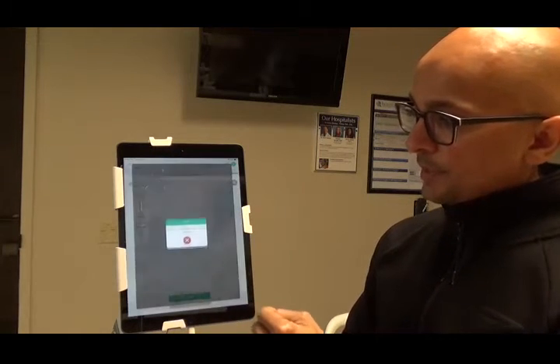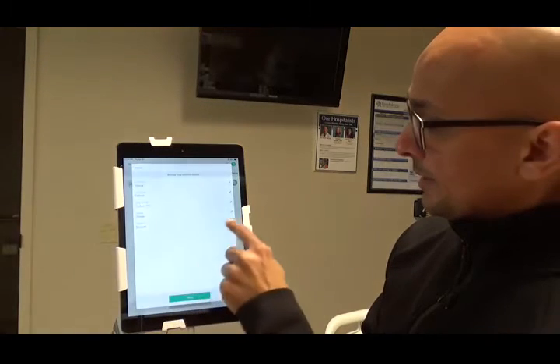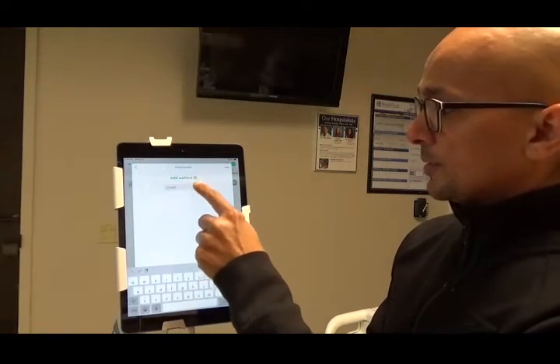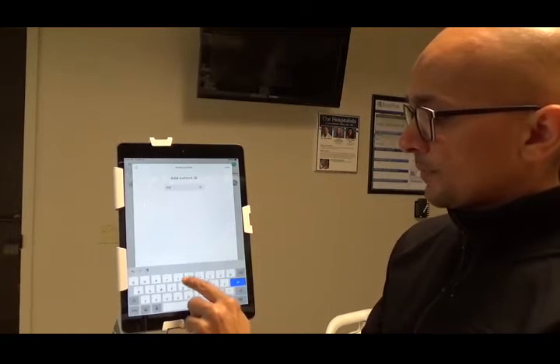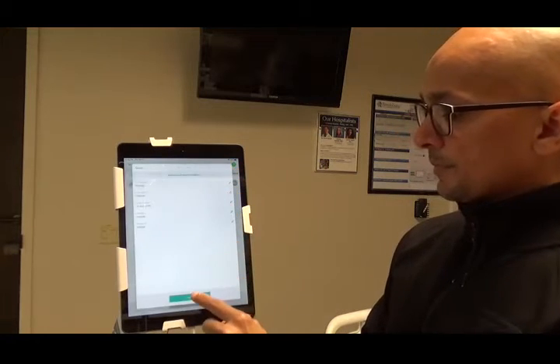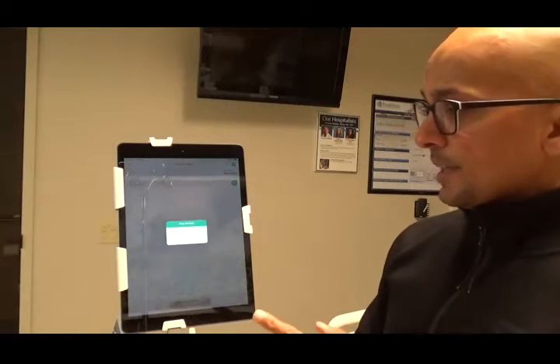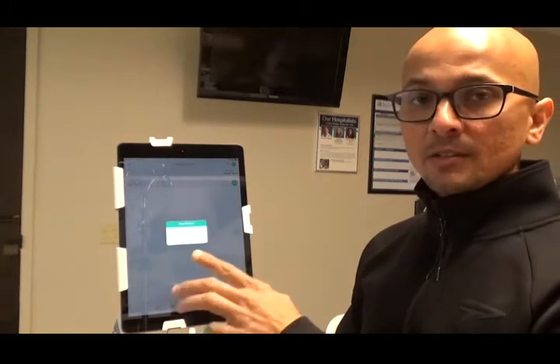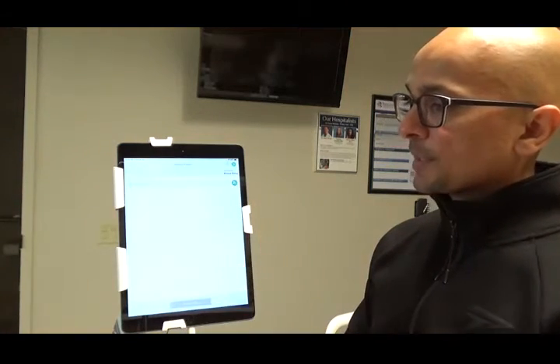Say save. Oh, one of the letters, because I put the and sign in there. That's why. So let me just take that out. We'll choose some random numbers. Okay, so now the patient is entered. Now it's asking me, would you like to continue with this patient? For right now, I'm just going to click no, but otherwise, you would continue with the exam.